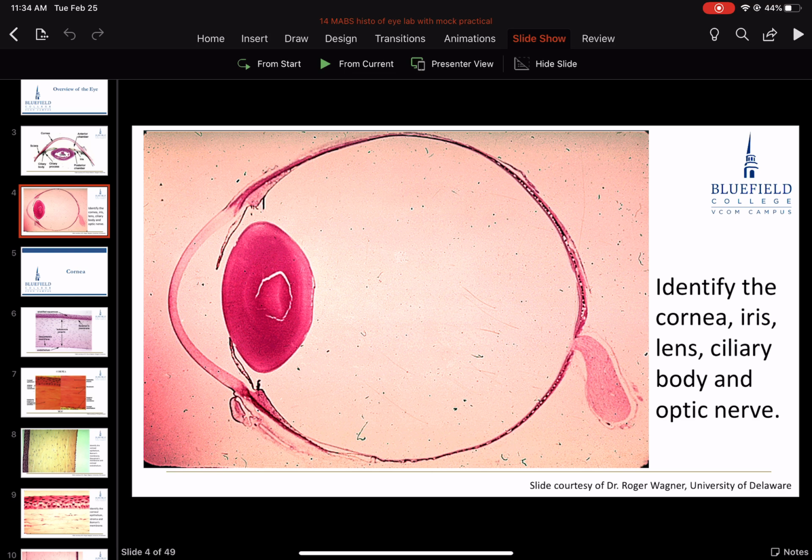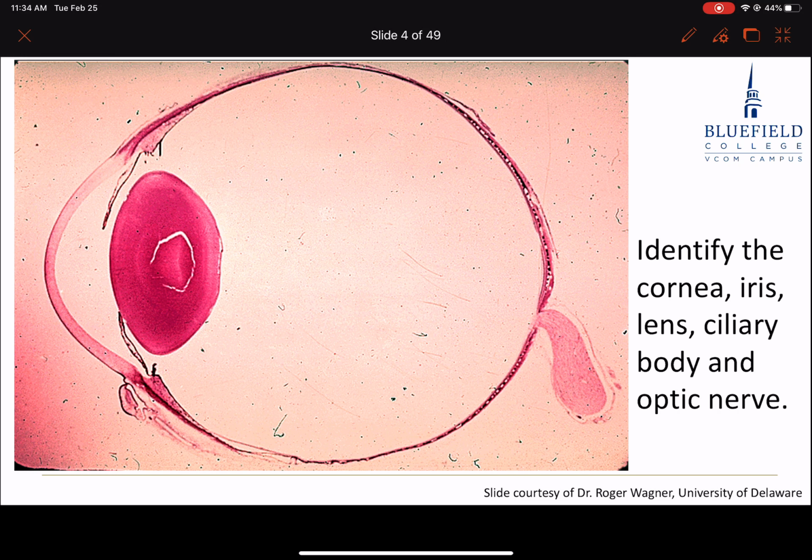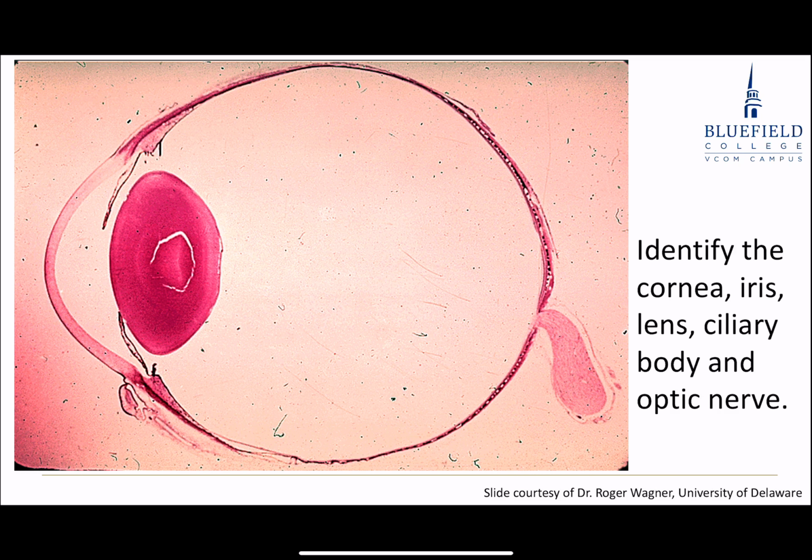And then not really, I mean, I see a dark stain in here. Maybe if I get back here, I can make out a little bit more in terms of choroid and retina, but I can do much better with images in terms of distinguishing those. And then back here would be my optic nerve coming out back, so there's my optic disc right there.